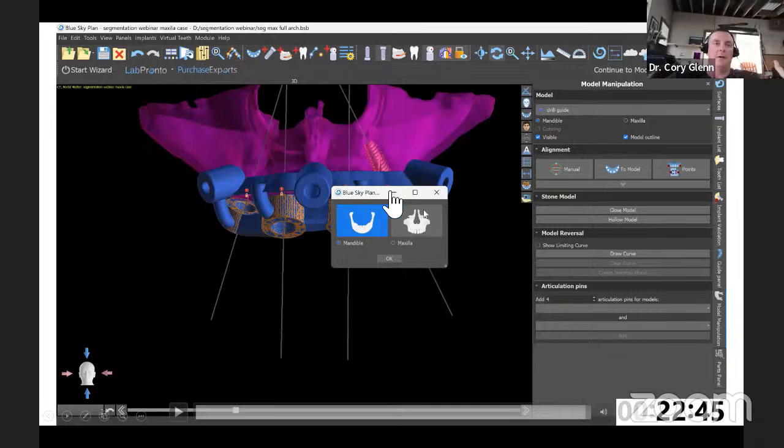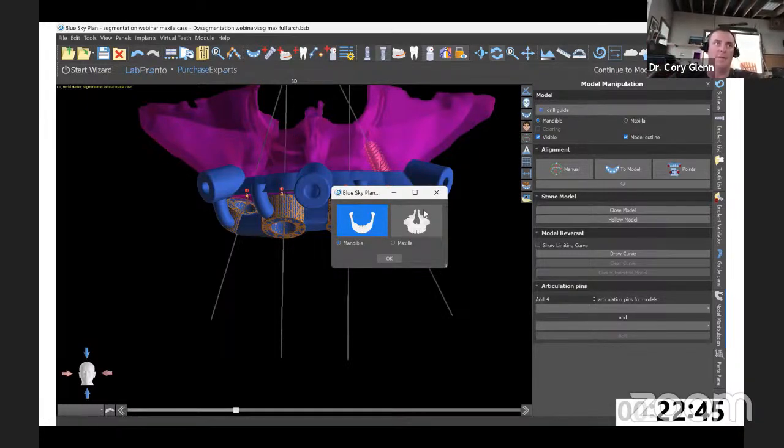Now, all of that said, the nice thing about resin printing is it's going to cost you like 75 cents to print these guides. So if you want to make it thin in dimension where it still goes in under your flap easily, your risk is going to be that it'll break. Well, okay, big deal. Print 4 of them. If you have something break during the procedure, take it out, throw it in the trash, and just stick in the new one, right? So there's pros and cons to metal versus resin.